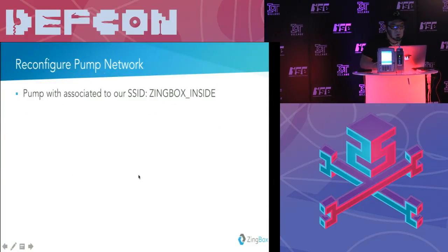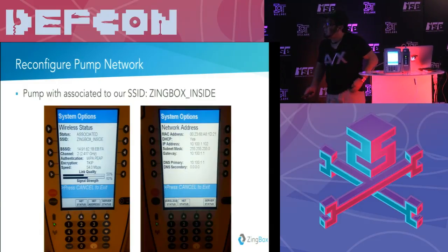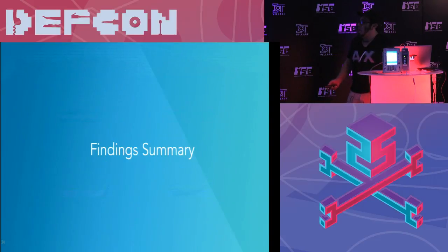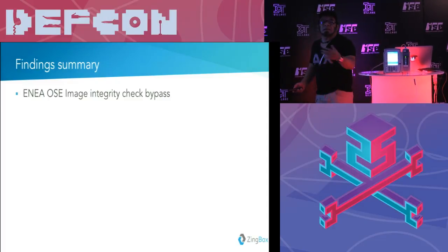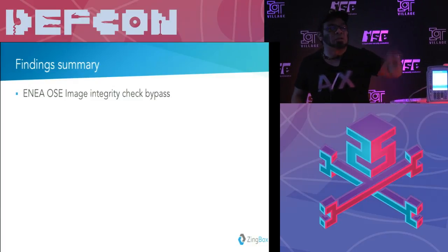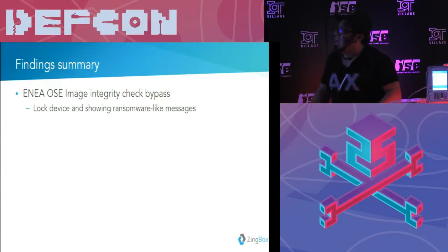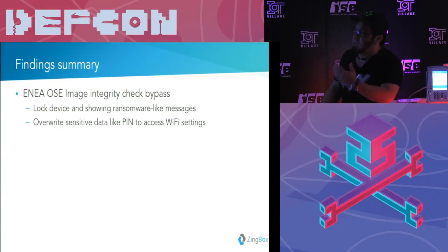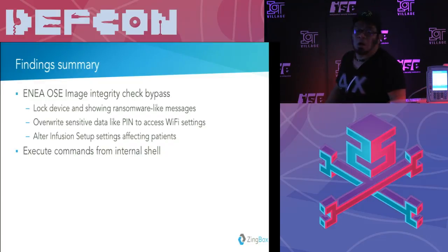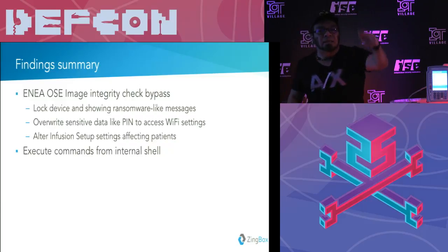Okay. So this is what we just saw. We saw that we got associated, and we got the IP address, which confirms that we can replace it. Finally, summary, we talked about the integrity check bypass, where we can change the forms, we can change the PIN numbers, and we can keep playing, right? It's up to us whatever we want to change, because at that point, the file can be altered. We talked about changing those settings, of course, the Wi-Fi settings. We talked about changing the infusion setup to affect the clients, you know, change the VTBI with the rate, and that can confuse.